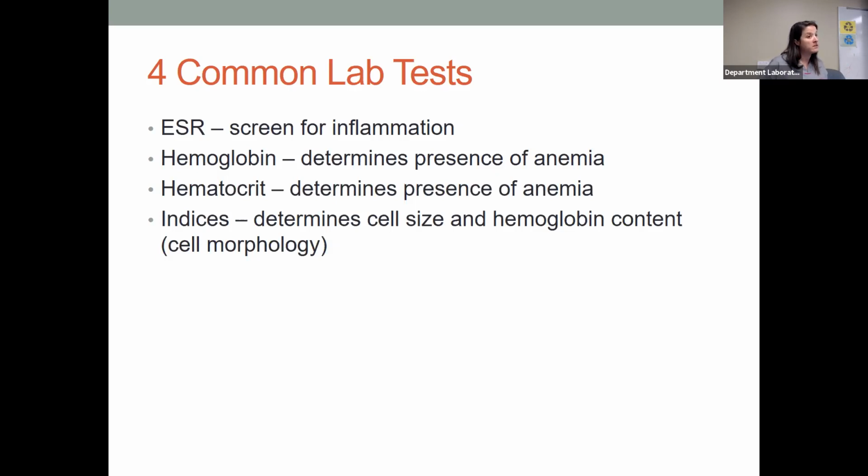Physicians love to order this test. I'm thinking reimbursement might be pretty good for this test because you will do it quite a bit in a hematology lab. However, if there is some type of condition present, whether it be multiple myeloma, or maybe the patient has anemia or anything like that, then that ESR could be a part of the whole patient picture. Does that make sense? Again, it's never diagnostic, okay? We use it in correlation with other results.